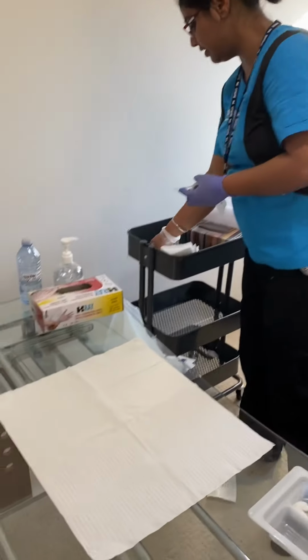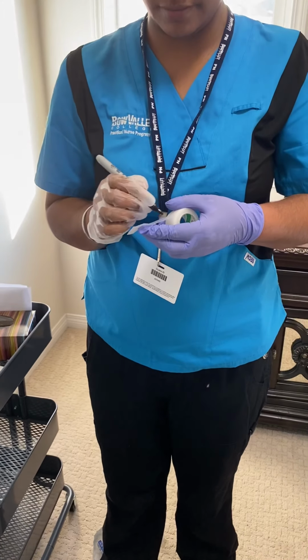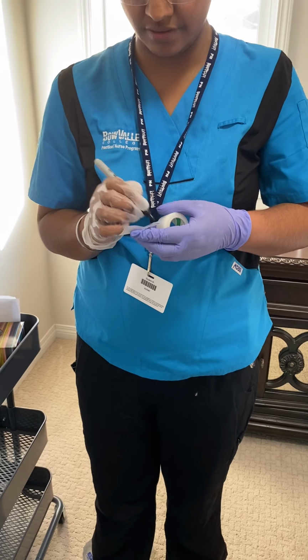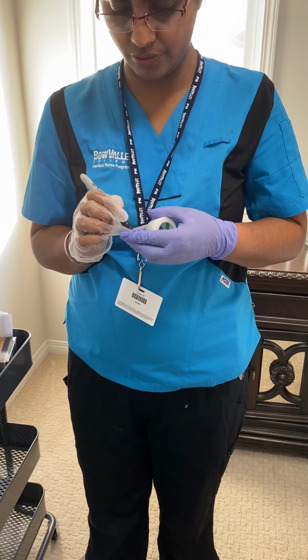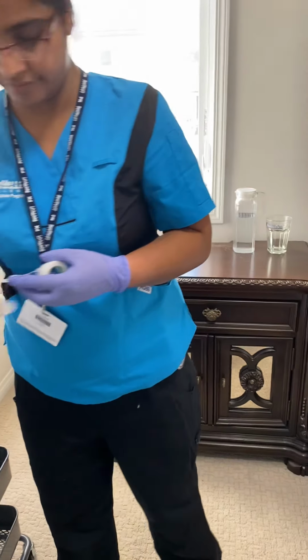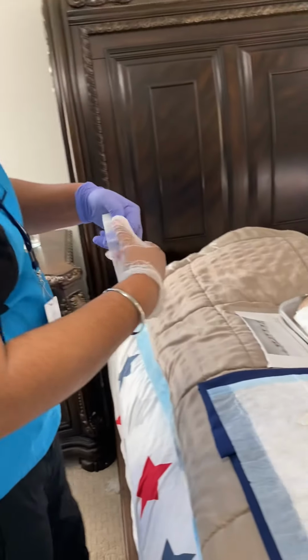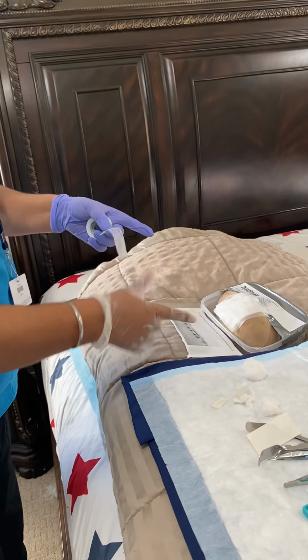Now I'm going to write my time, date and initials on another piece of tape. Here I have a pen. I'm going to write time 11, date 6 October 2020 and my initials. Now this tape I also apply on one side of the wound.